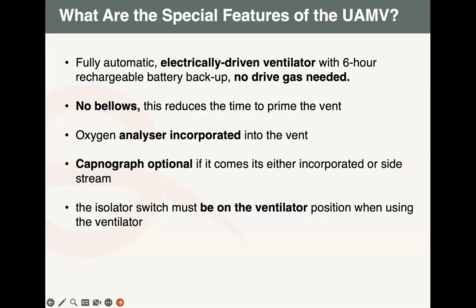Remember, the FiO2 is different from the SpO2. So the FiO2 that you are giving to the patient will be displayed on the UMV, and the SpO2 is going to be displayed on the patient monitor.